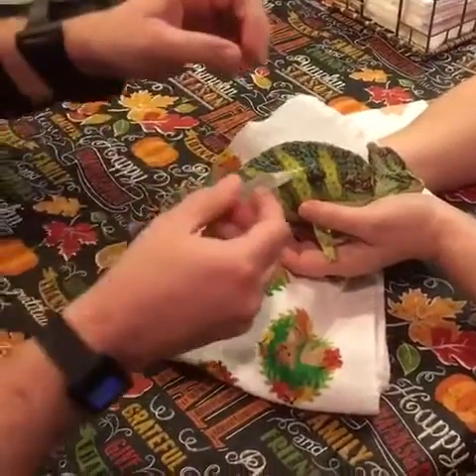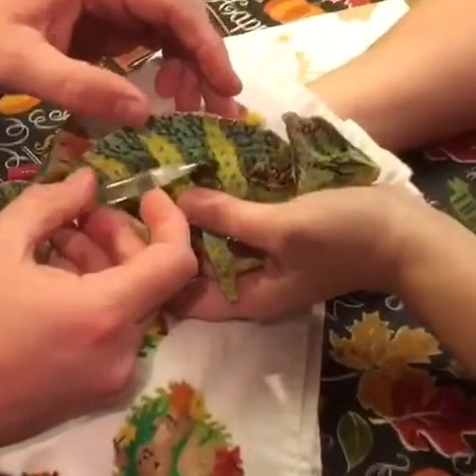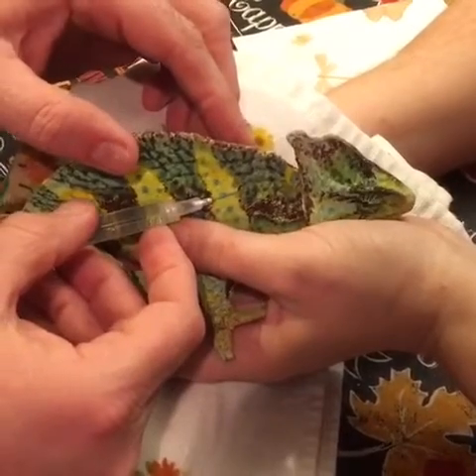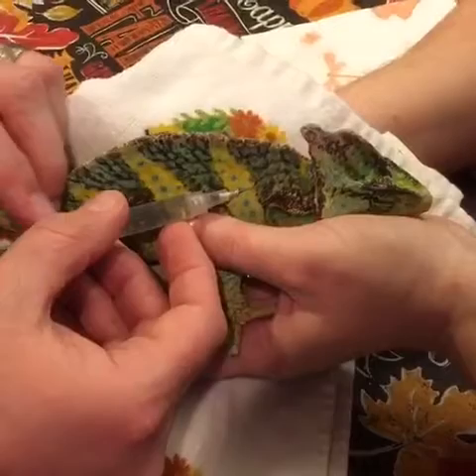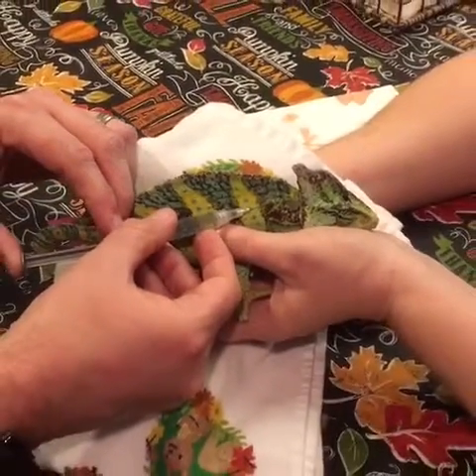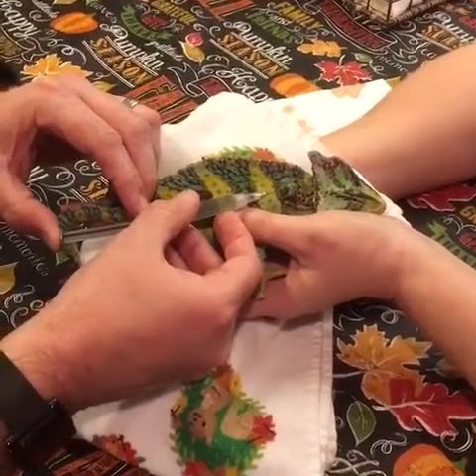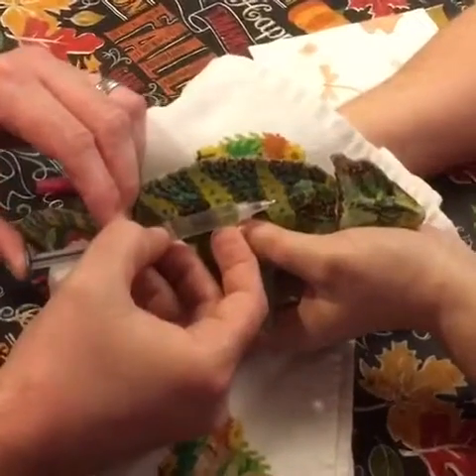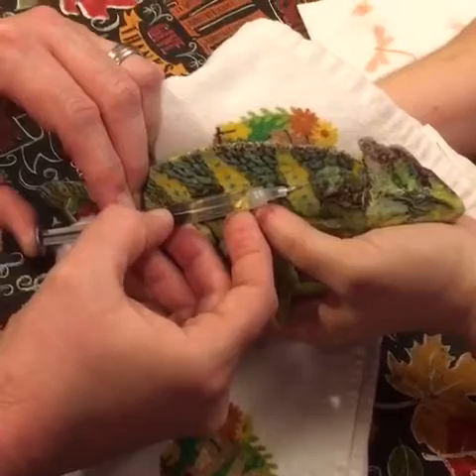We want to go right underneath the skin, making sure the bevel of the needle is oriented correctly. We put about 1.5 cc's of fluids into a little pocket on his side. He's gotten pretty used to us doing this. We'll give him 3 cc's total.